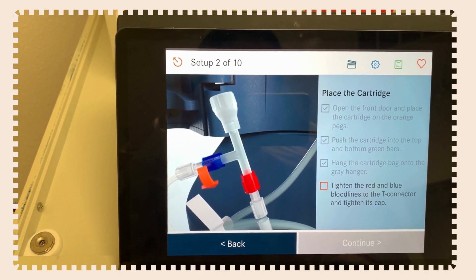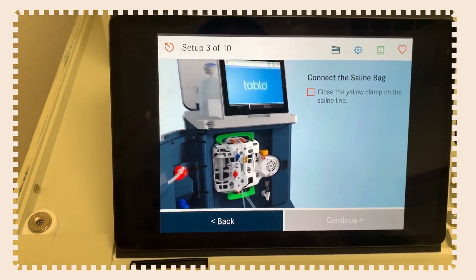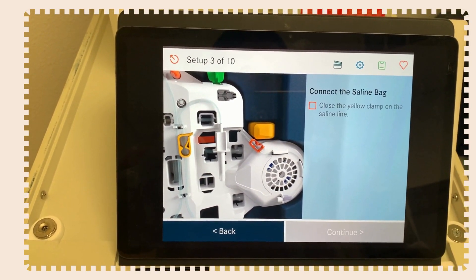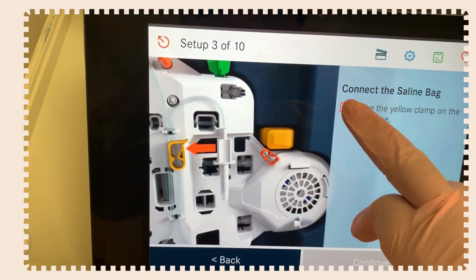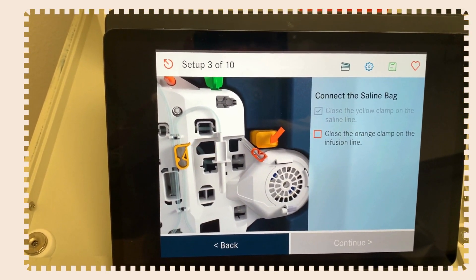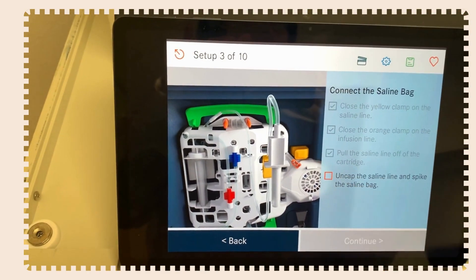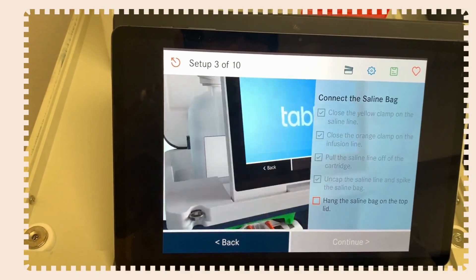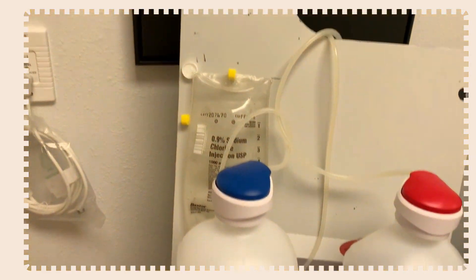Tighten the red and blue bloodlines and the T-connector. Now connect the saline bag: close the yellow clamp on the saline line, then close the orange clamp on the infusion line. Pull the saline line off the cartridge, uncap the saline line, spike the saline bag, and hang the saline bag on top.